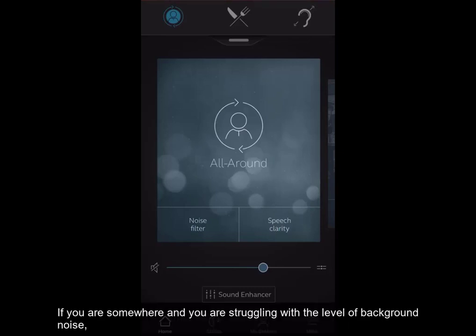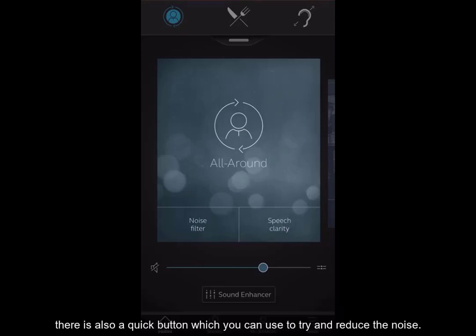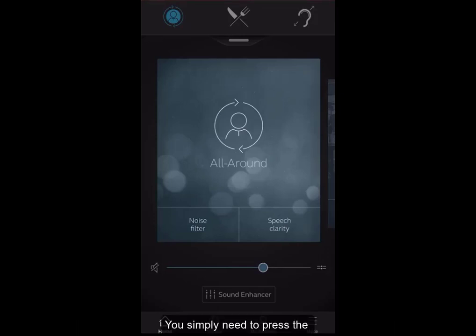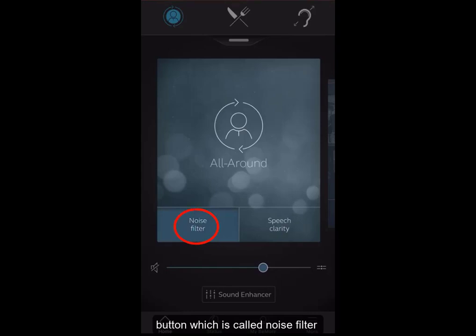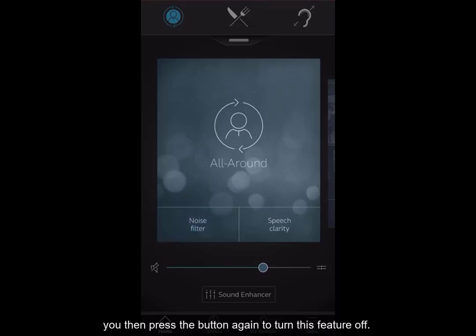If you are somewhere and you are struggling with the level of background noise, there is also a quick button which you can use to try and reduce the noise. You simply need to press the button which is called noise filter. This will turn the feature on, and you then press the button again to turn the feature off.